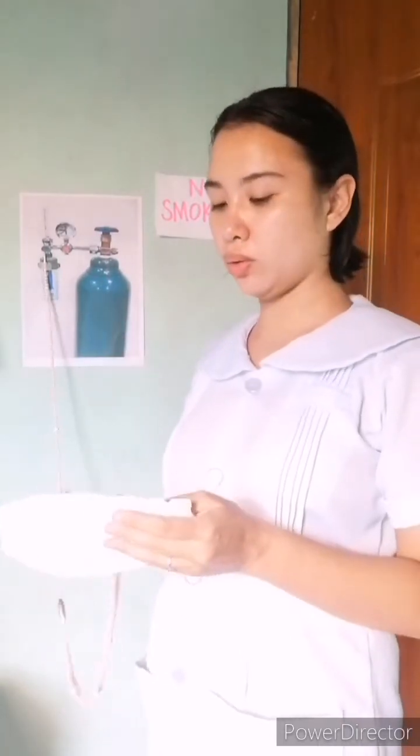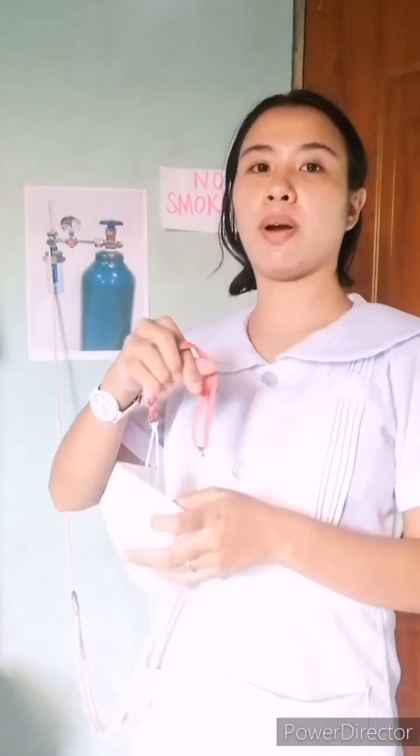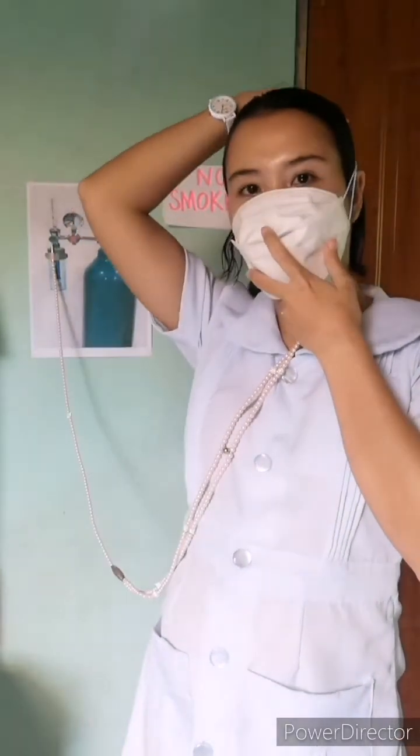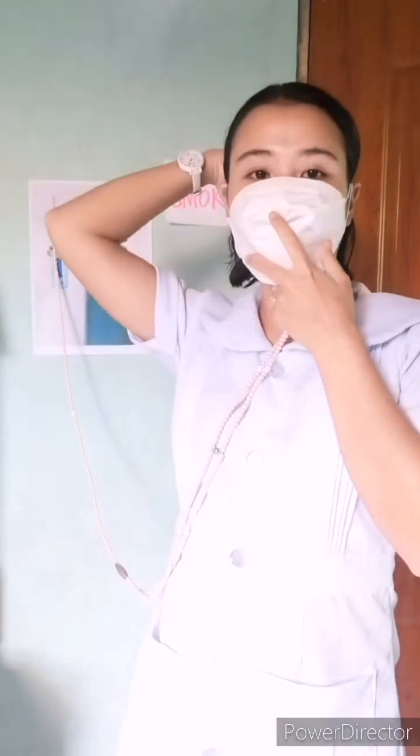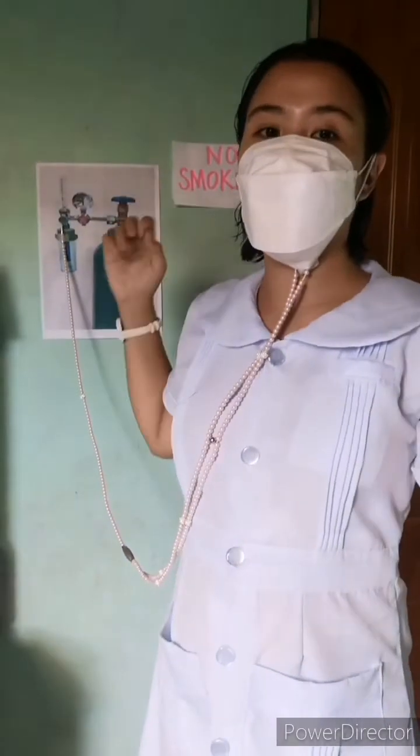So now I'm going to show you how to put the oxygen mask on the patient. We're going to guide the mask toward the client's face and apply it from the nose downwards. Fit the mask to the contour of the client's face. The mask should mold to the face so that very little oxygen escapes to the eyes, and the cheeks and chin will be secured.